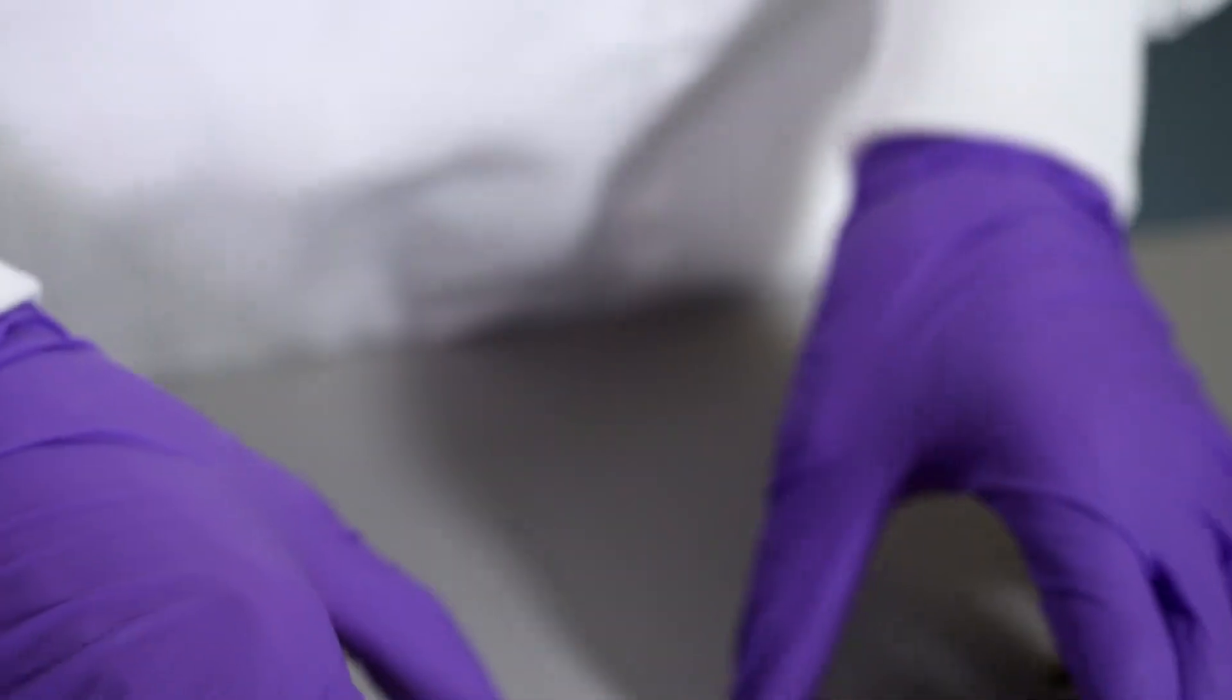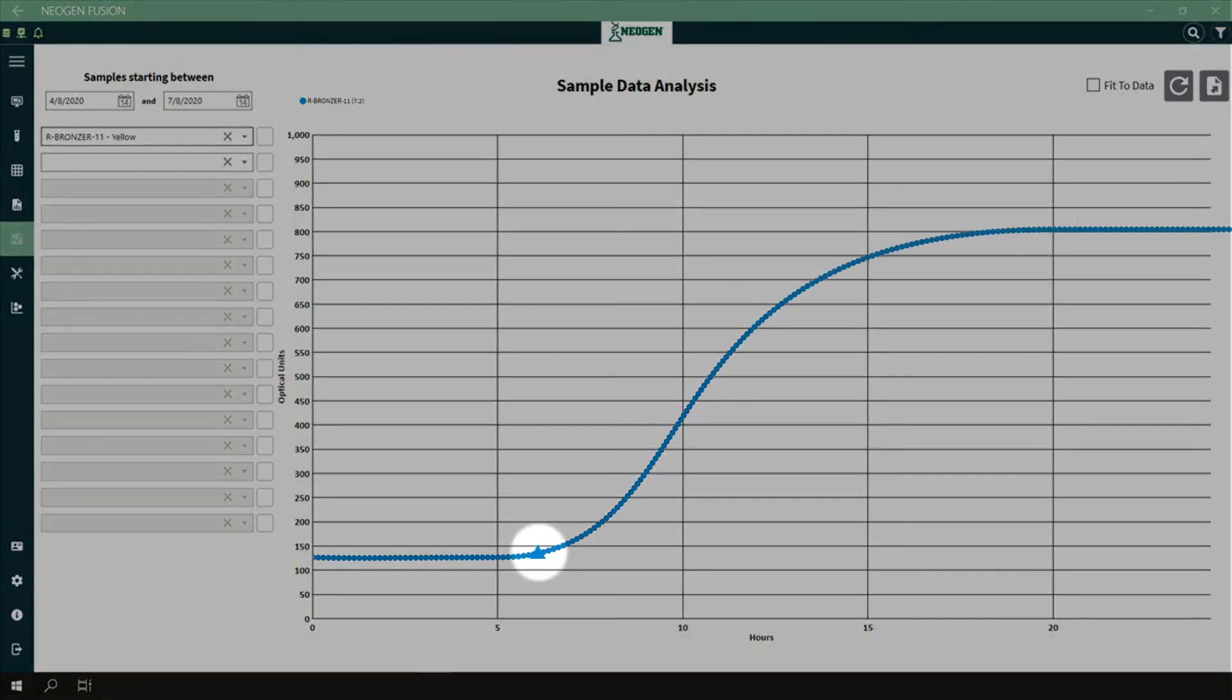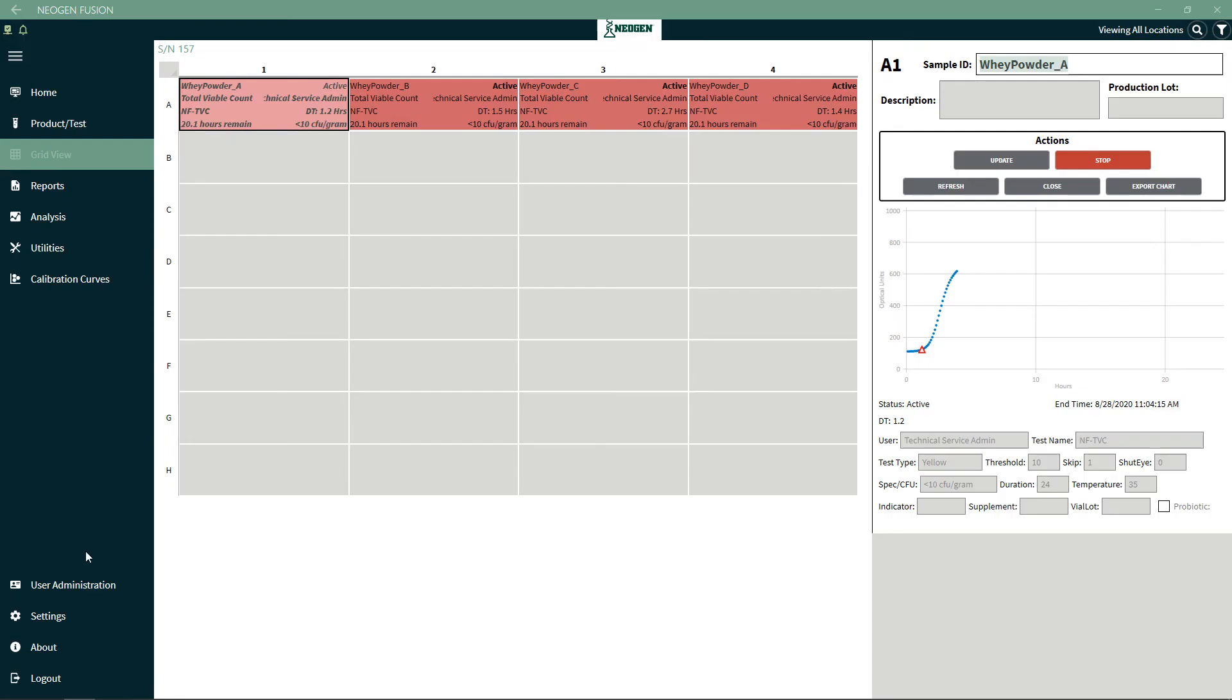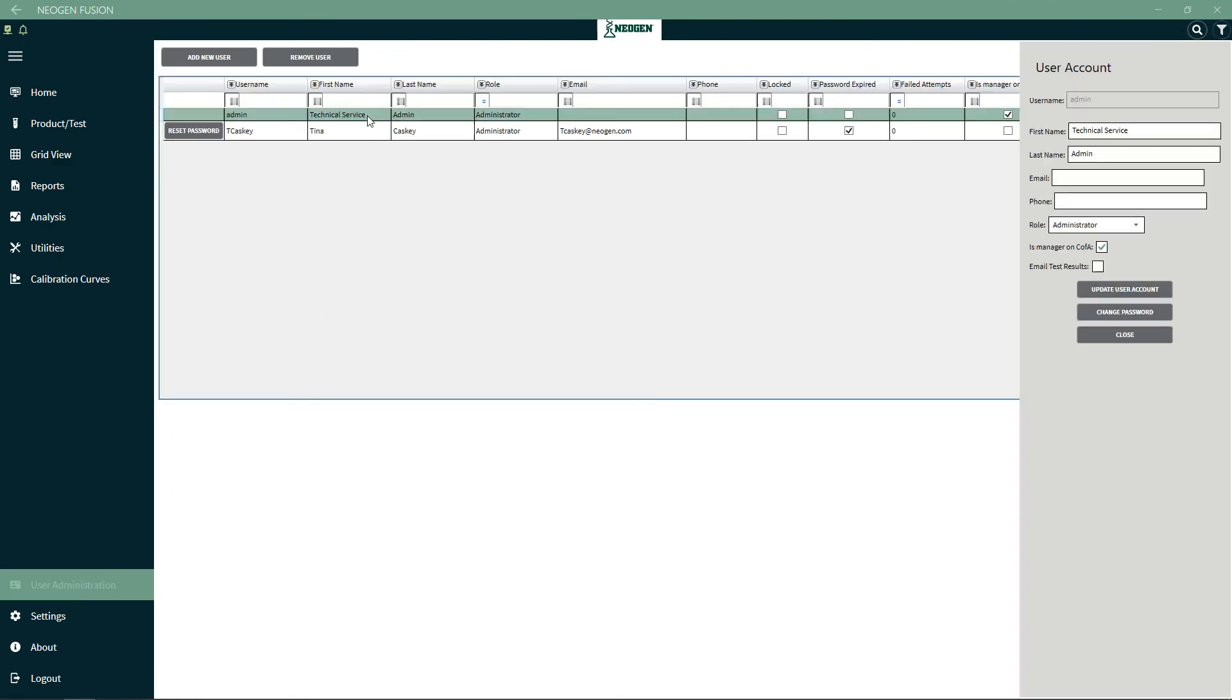The software also notifies the user of early detections, which allows for more timely decisions regarding the disposition of the product. Solaris includes visual, text message, or email alerts for out of specification results, so you are always in the loop with your testing.